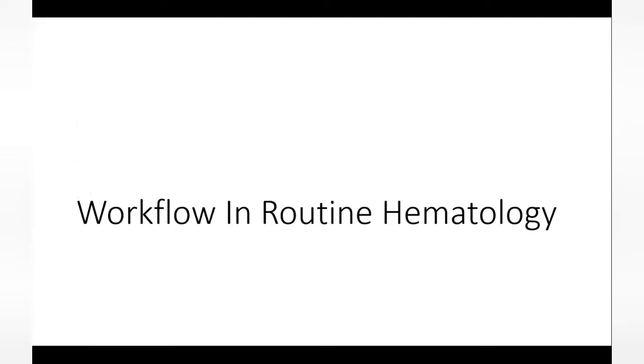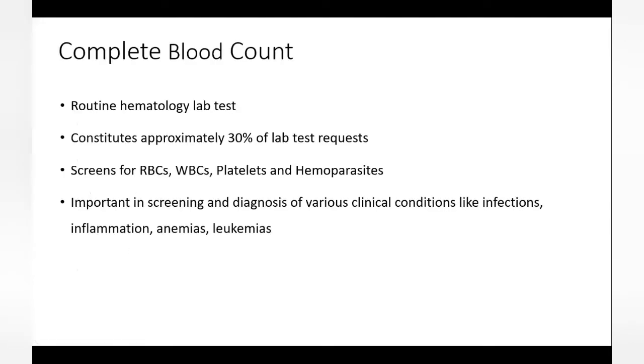So we all know that the workflow in routine hematology is basically our CBCs, which form the bulk of our reporting in any laboratory, whether it's a small lab or a big lab or a hospital. We know that one of the common tests asked for is a CBC, and it roughly constitutes anywhere between 25 to 50% of the test requests that we get on a routine day.